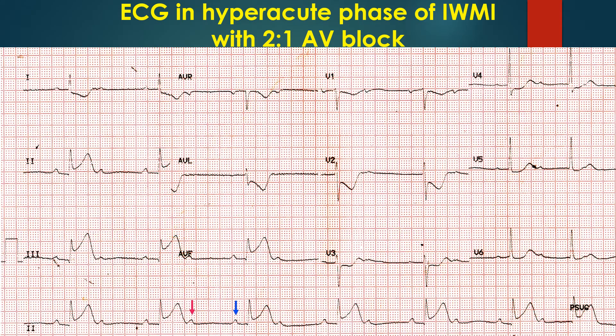ECG in the hyperacute phase of inferior wall myocardial infarction with 2:1 AV block shows two P waves for each QRS complex, indicating 2:1 AV conduction. Upsloping ST segment elevation is seen in leads II, III and AVF — the inferior leads — with T waves in these leads tall compared to the amplitude of QRS complexes. ST segment depression is seen in leads I, AVL, and V1 to V6. ST depression in I, AVL, V1 and V2 are downsloping, while those in V3 to V6 are horizontal. T inversion is noted in V1 and V2.